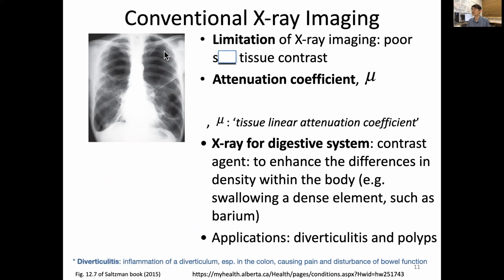So very poor. That is poor soft tissue contrast, because the contrast mechanism is the absorption of the X-ray, and bone is the most easily absorbing of the X-ray.